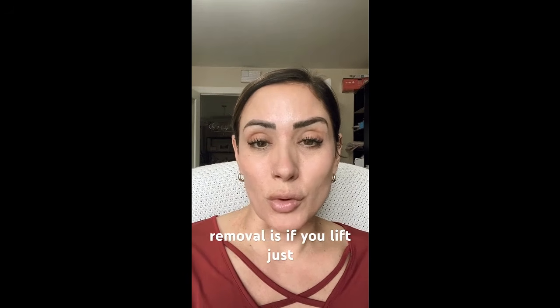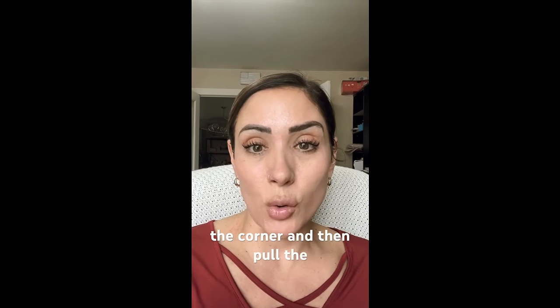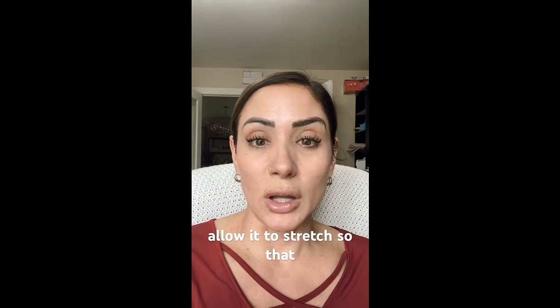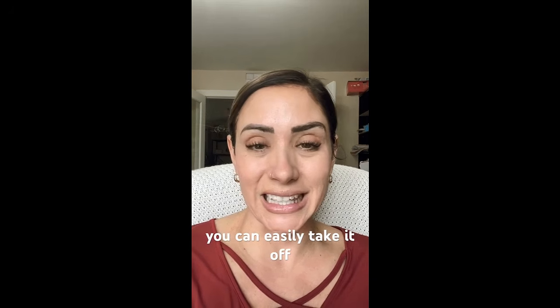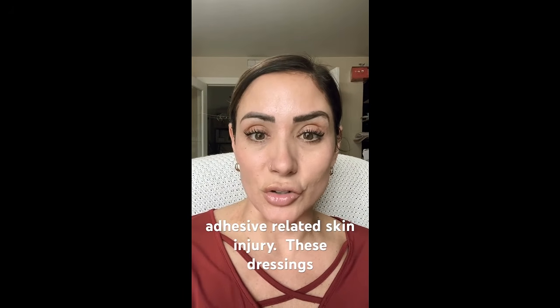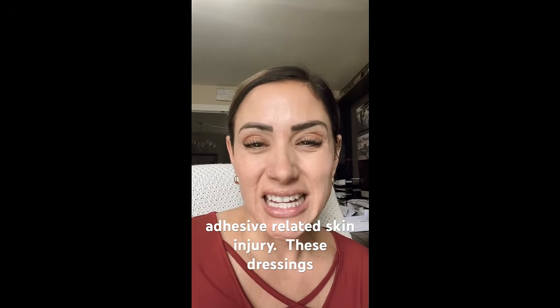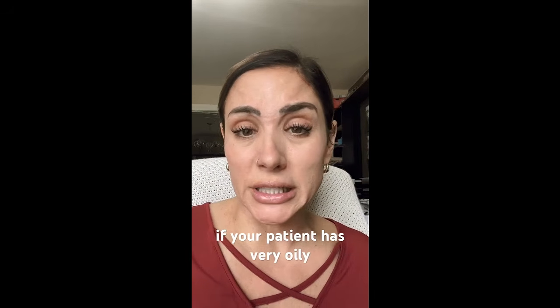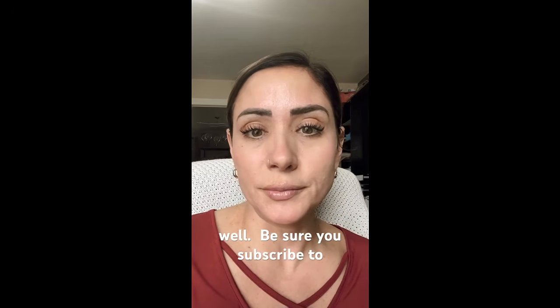And just a tip with removal is if you lift just the corner and then pull the corner of the transparent film to allow it to stretch so that you can easily take it off, you're going to avoid a medical adhesive related skin injury. These dressings may not be a great option if your patient has very oily skin or sweats a lot as well.